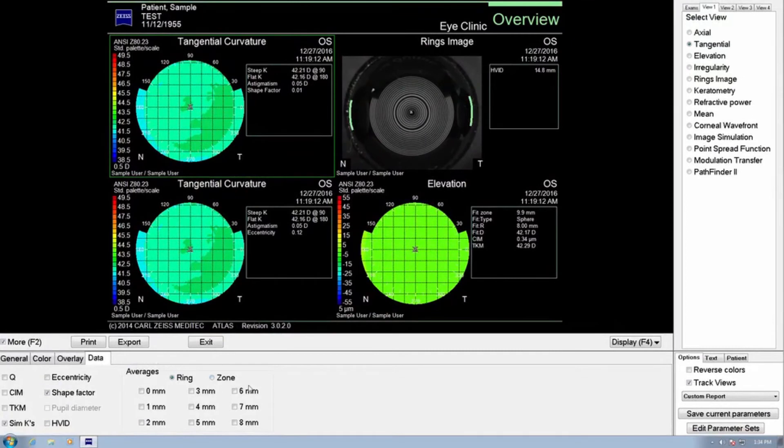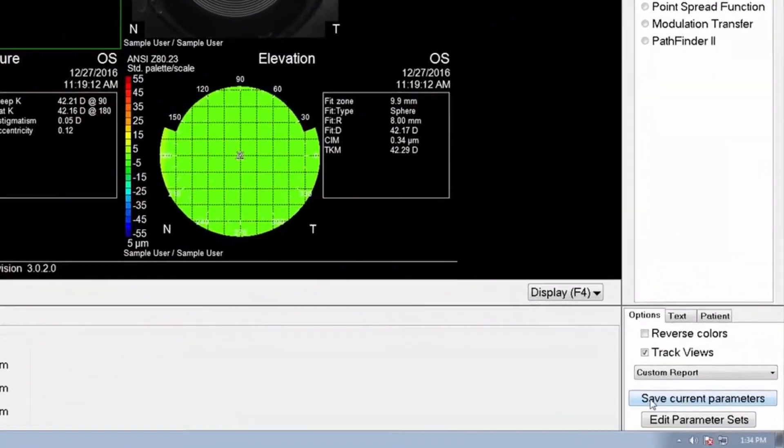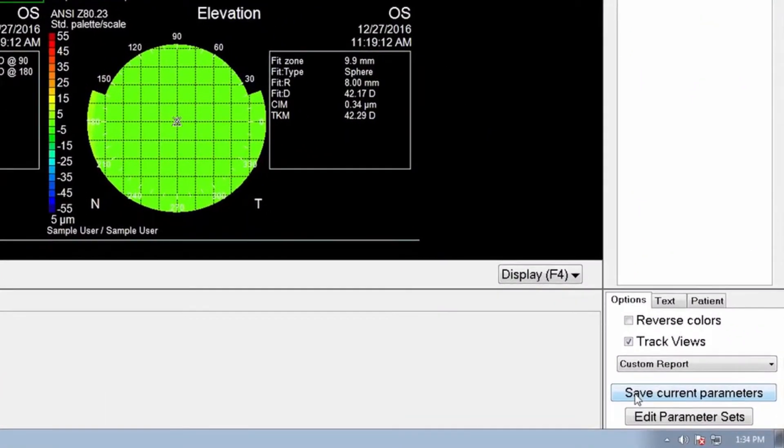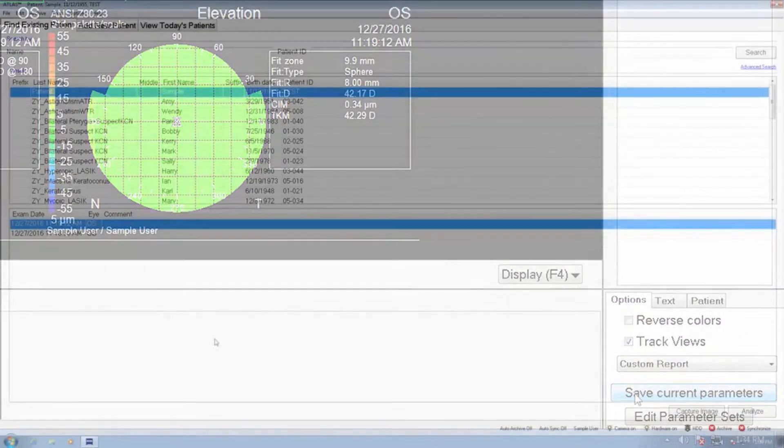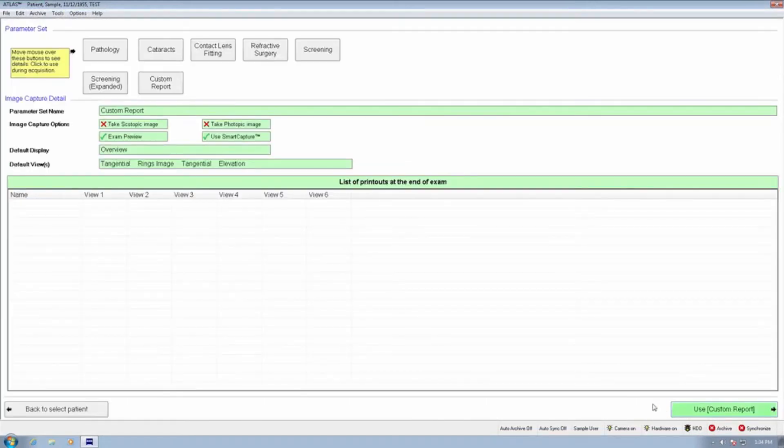Once you've chosen your desired views for the report, click Save Current Parameters located in the lower right corner of the screen and select Exit to return to the main menu. You can now use this report when you capture your next image.